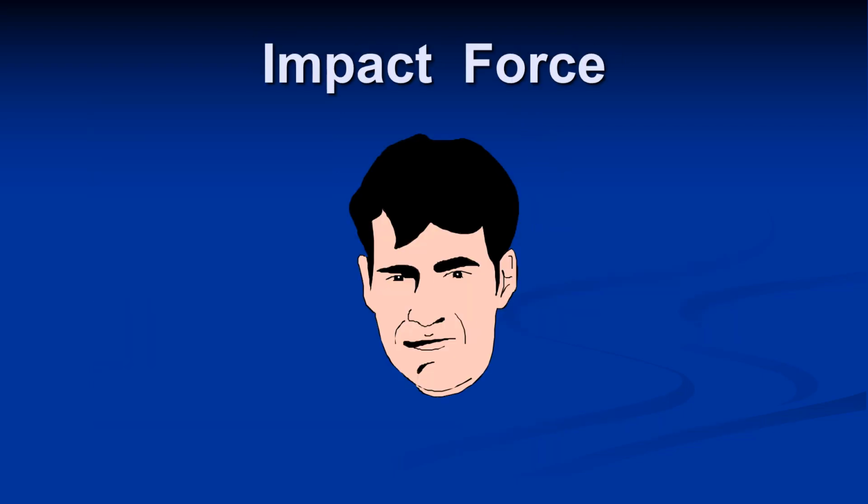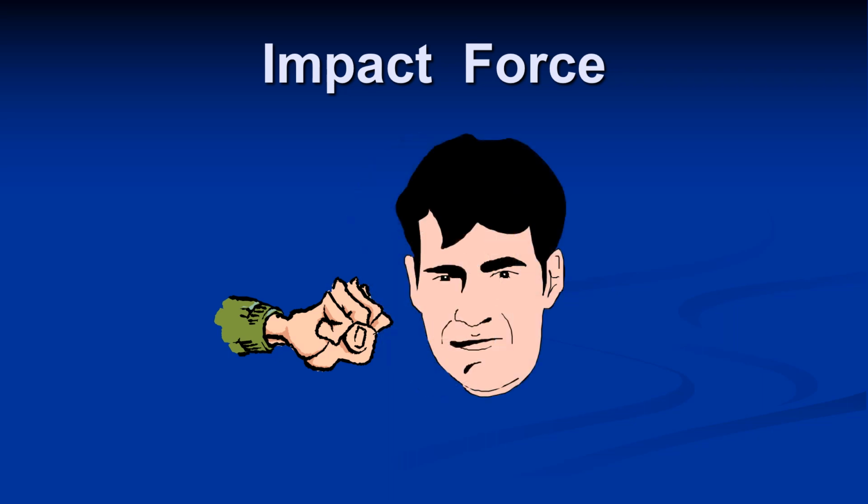This animation demonstrates the function of US power and vacuum. When we hit someone's face, his head will bounce away and he may not hurt much. This is similar to Phaco sculpting.